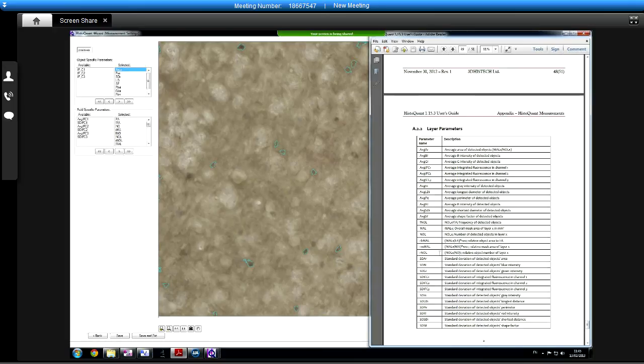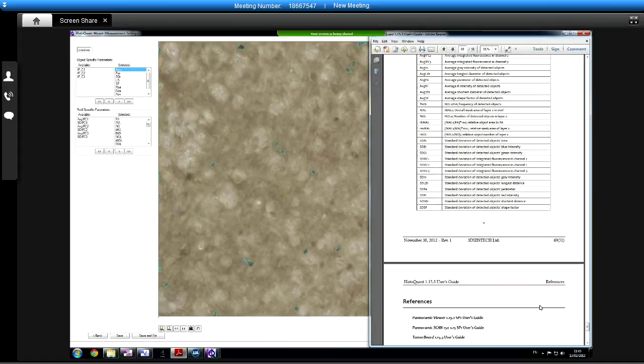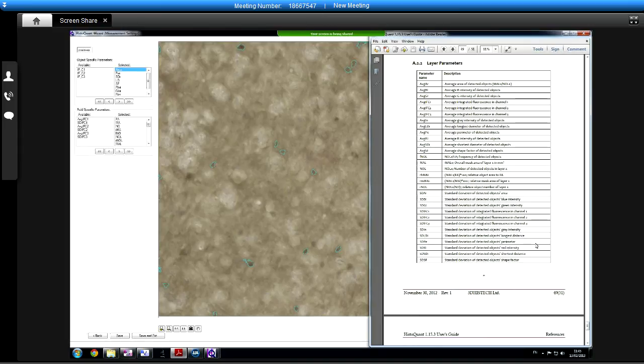So I would just say, at some point, depending on what you're trying to quantify, pick your time, just look through these and say, oh, that's actually the exact thing I want to know, or that indicates the thing I want to know. Does that make sense? I'd say they're just in the appendix at the back of the manual.